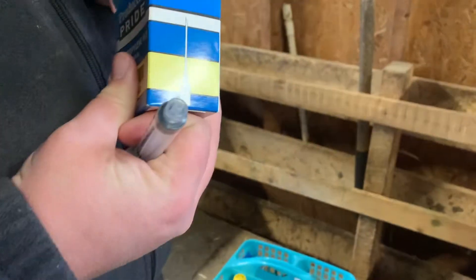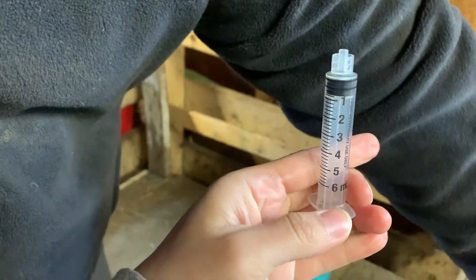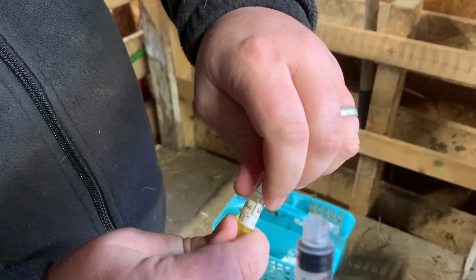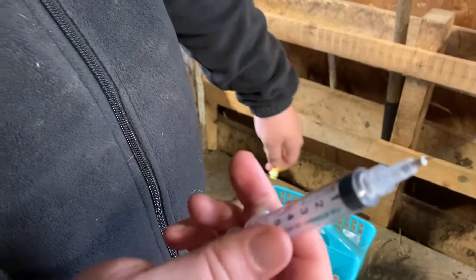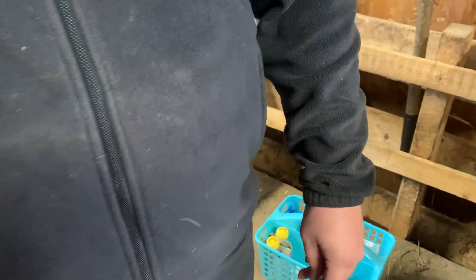Hey guys, welcome back. Today we're in the barn and we are going to be drawing labs to do testing for our herd. We're gathering all our supplies — you're going to need a 6cc syringe and 20-gauge three-quarter inch needles. These are easy to use: you twist them off, take off the top, put the syringe in, twist and screw it, and then you have your needle and syringe.